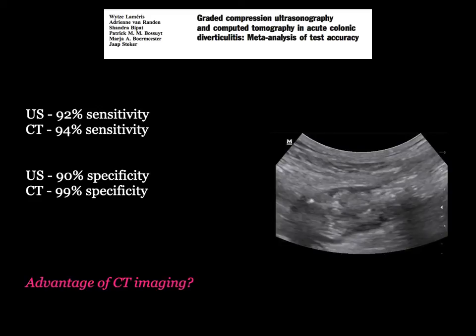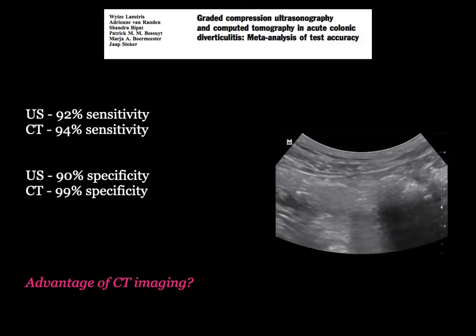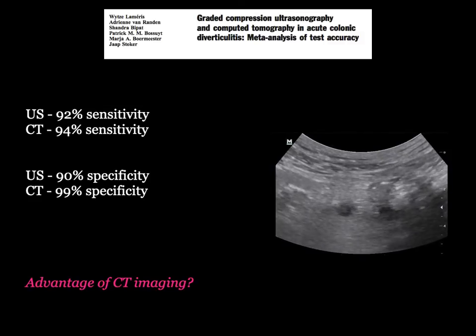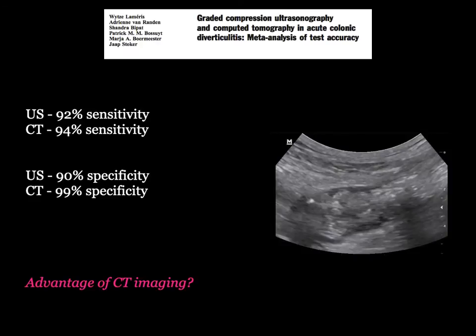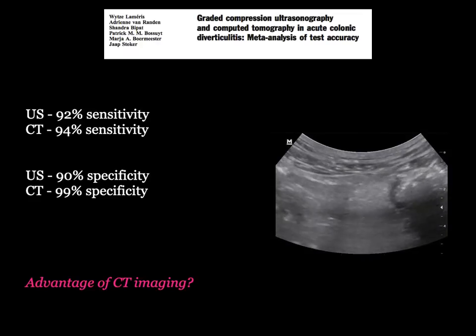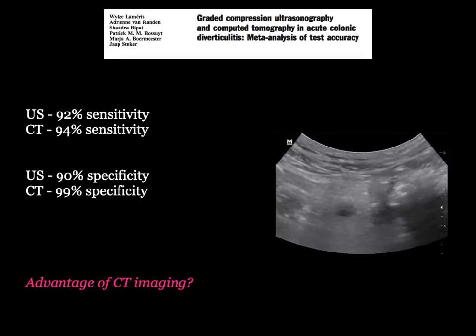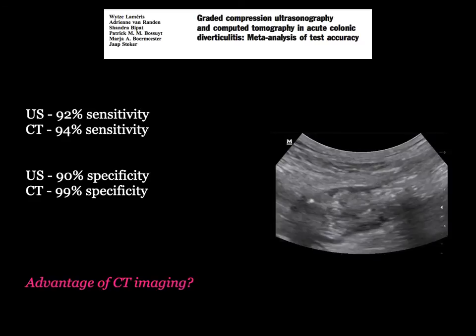And what they demonstrated was that there was no statistically significant difference between ultrasound and CT when looking at the sensitivity and specificity to make this diagnosis. So this is huge and demonstrates that ultrasound can not only accurately, but in our case using point of care ultrasound, very quickly make the diagnosis at the patient's bedside, obviating the need for CT imaging and decreasing a patient's length of stay in the emergency department.